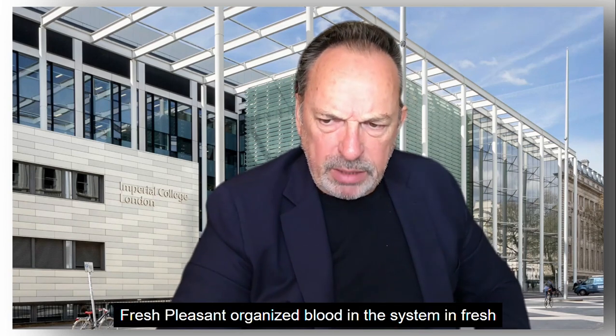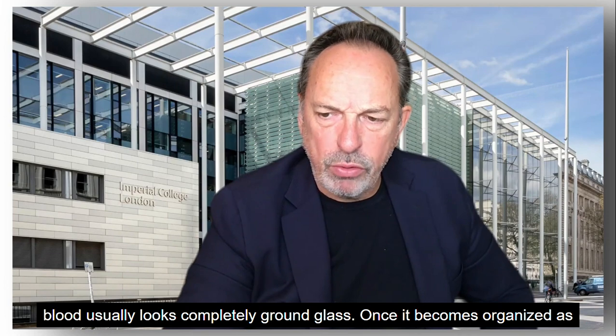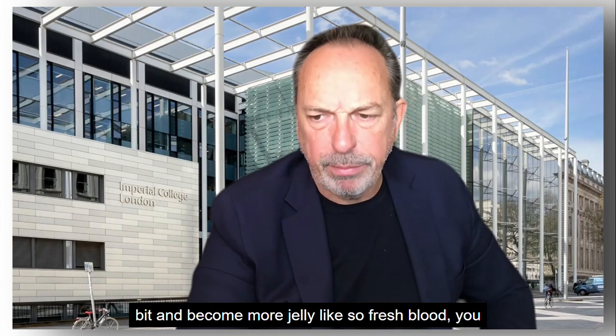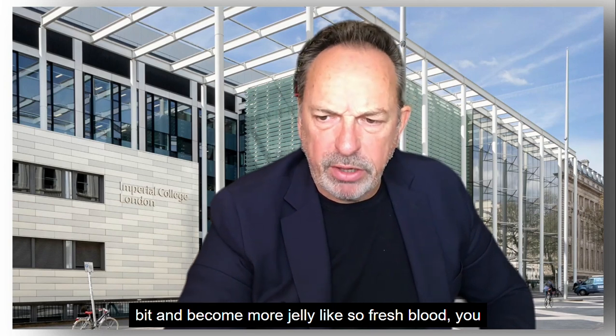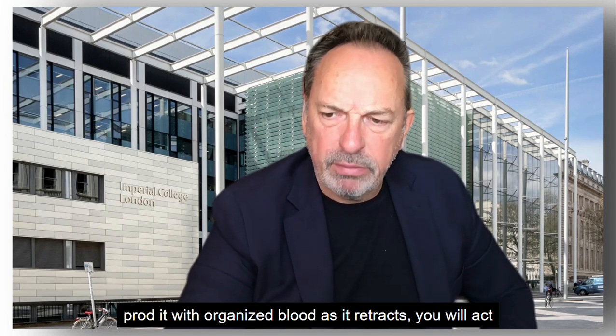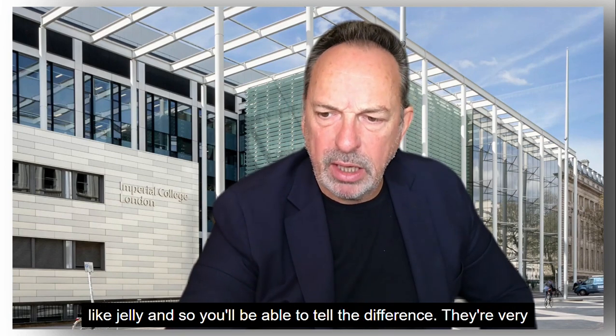Fresh blood and organized blood in a cyst. Fresh blood usually looks completely ground glass, and once it becomes organized, as you can see in some of those pictures, it tends to retract a little bit and become more jelly-like. So fresh blood sometimes won't wobble when you prod it, but organized blood, as it retracts, will act like jelly, and so you'll be able to tell the difference.